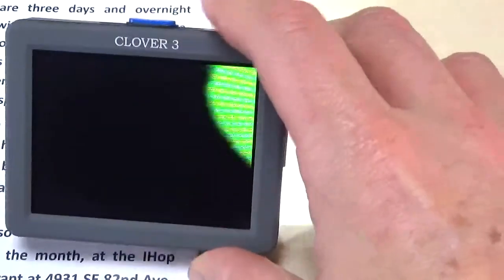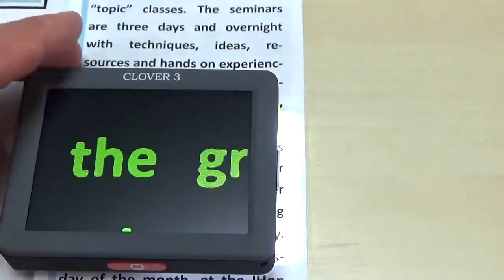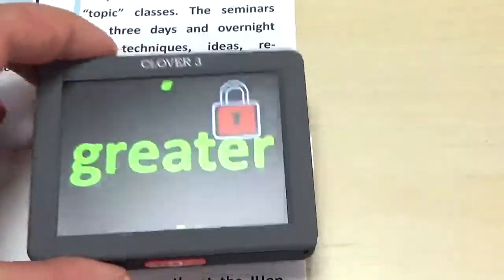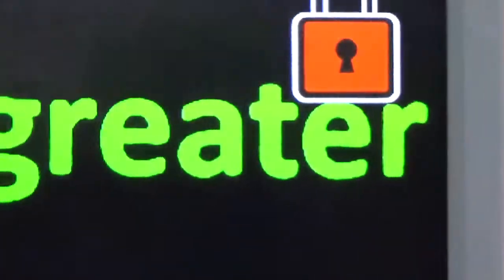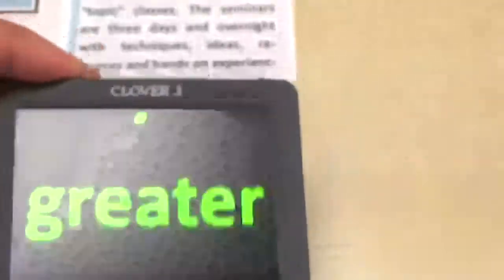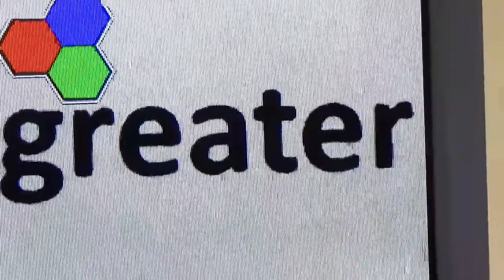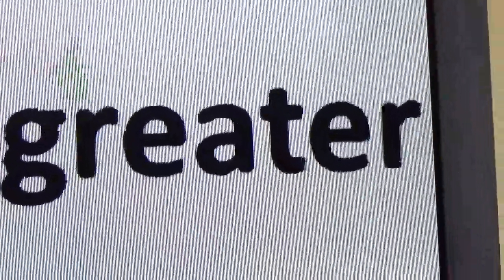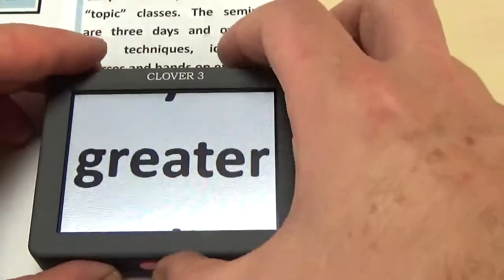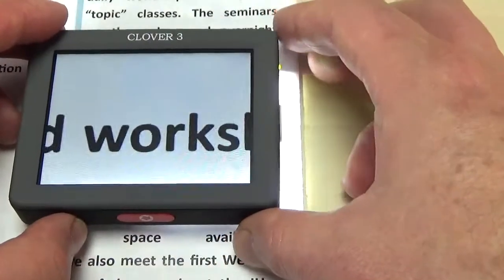Alright, so if we want to read, just place it on top of the reading material and off you go. Freeze that, take a look. It gives you a nice clear image on there. You can use various contrasts. I guess you'd typically use the black on white there. I'll unfreeze that image. Real easy to use, not much to it.